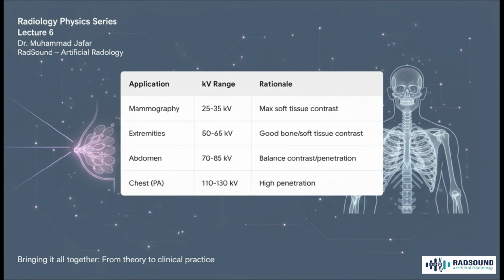Look at mammography. We need to see tiny, subtle differences in soft tissue, so we slam the kV way down to maximize that photoelectric effect. But then look at a chest X-ray. We have to blast through the dense spine and heart, so we use a really high kV to get the penetration we need, and we just have to accept that we're going to have lower contrast.